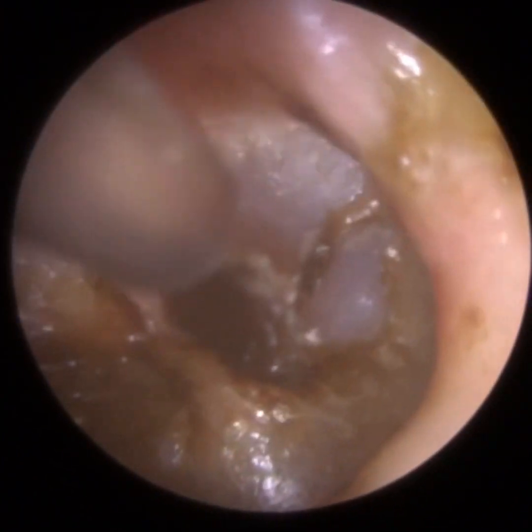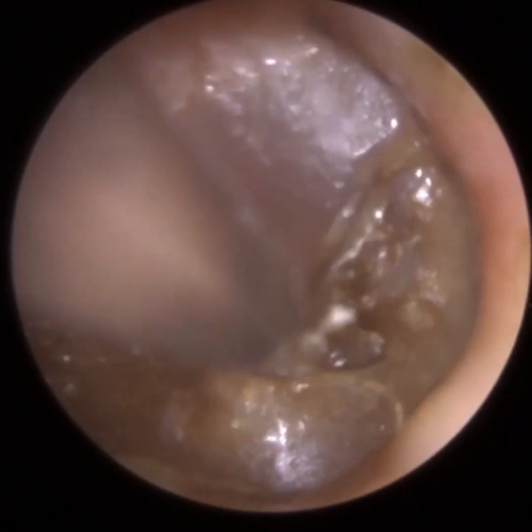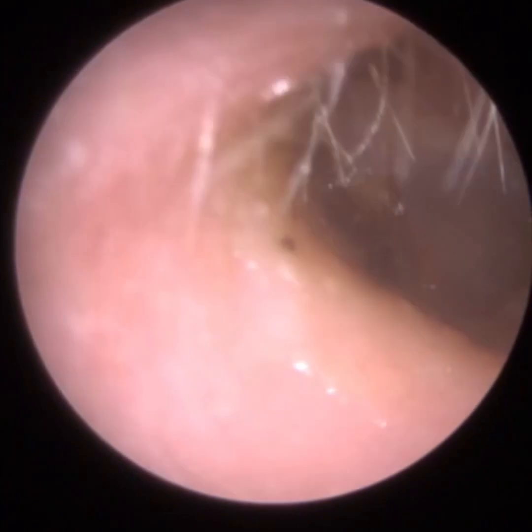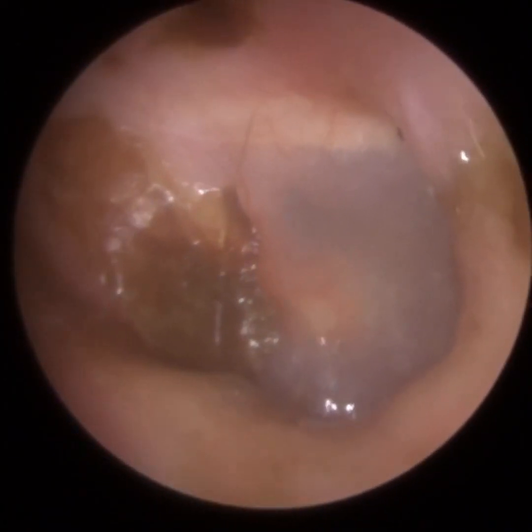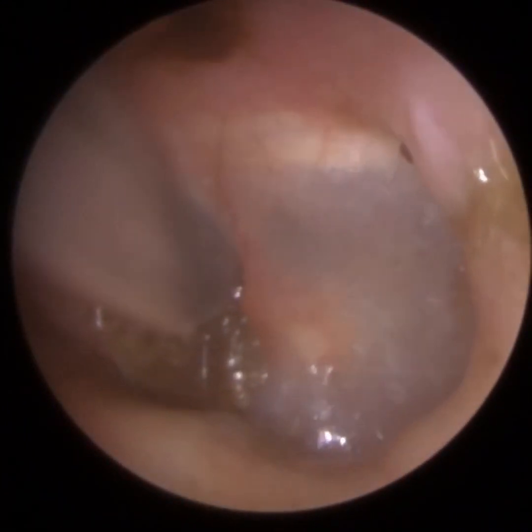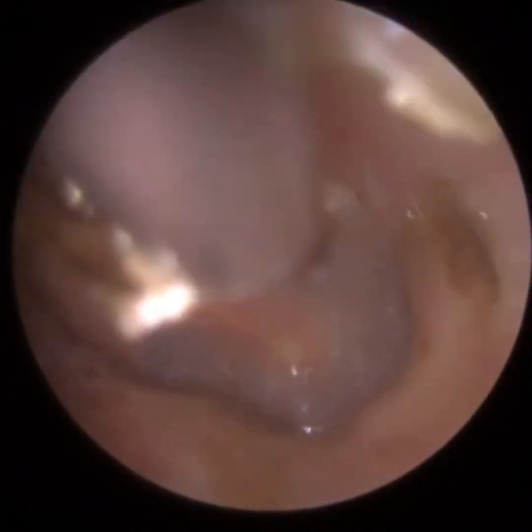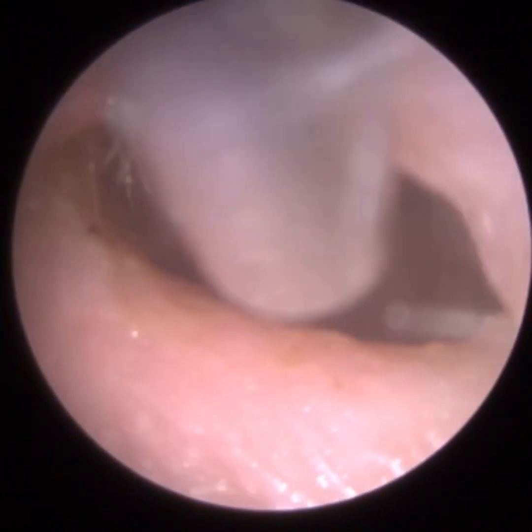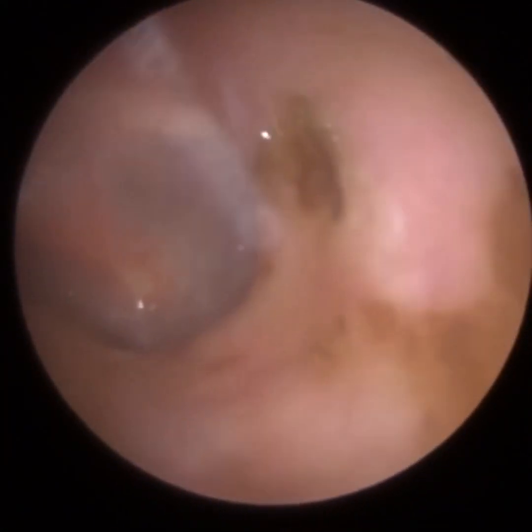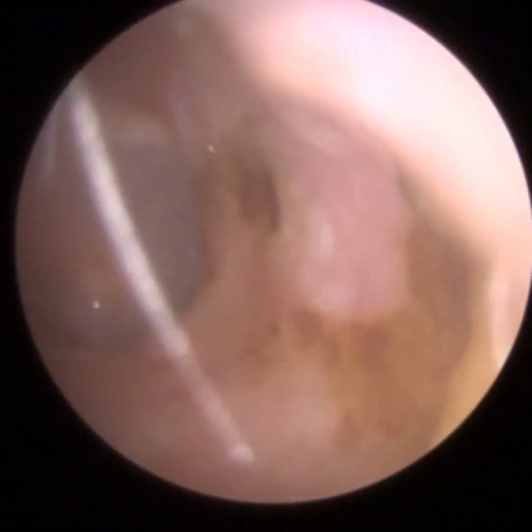We're just on the eardrum here — you can see this crusty layer of dead skin being slowly peeled off. You need a really steady hand; we don't want to cause any injury or make contact with the bony part of the ear canal or the patient's eardrum. You can see three quarters of the patient's eardrum, and it's just the superior anterior quadrant remaining — and slowly but surely I managed to peel that off as well. At the end of this procedure I'm going to show you the pre-examination video so you can compare what it was like before and after.